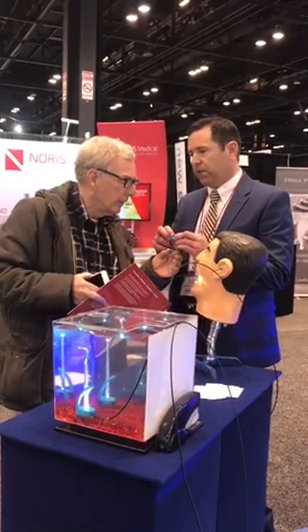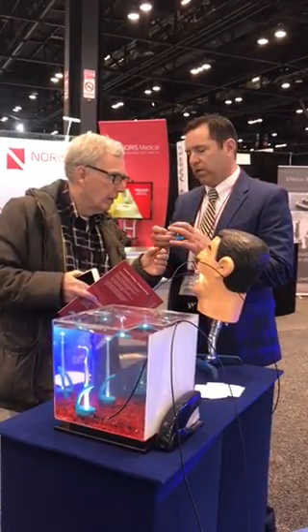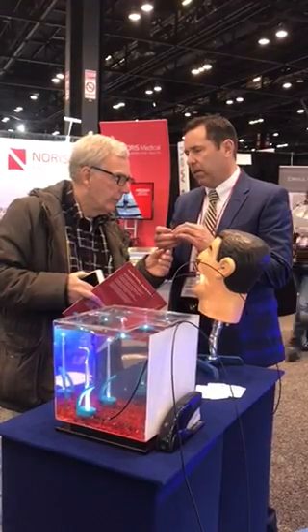It's got this rubber — this is a 60 durometer outside rubber piece. So your teeth kind of sink in. When you bite down, it kind of gives a little.